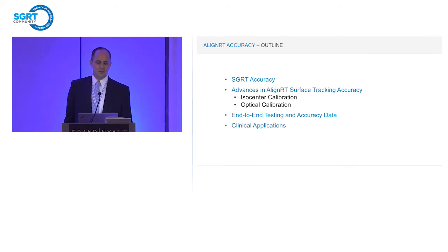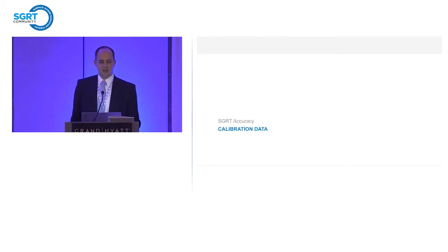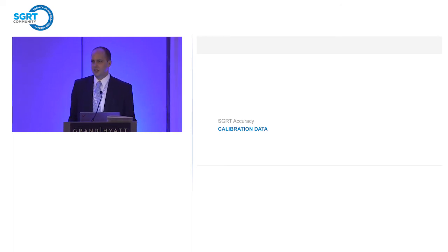All right, so there's many different factors, as I'm sure you're all aware, that contribute to the accuracy of an SGRT system. Kind of core to all of that is a good calibration. So good quality calibration data defining the optics of the system are key. Without this, it doesn't matter what else we do with our ROIs, with our skin tone selection, all that. Nothing would matter if the calibration is not as good as it can be.